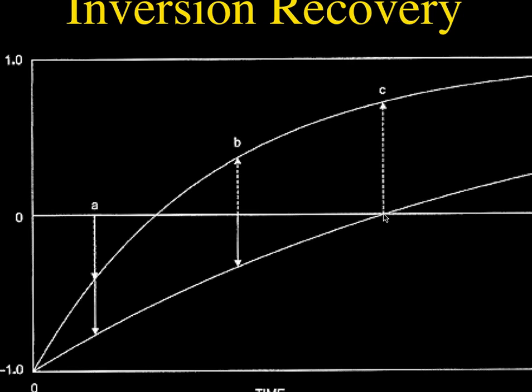It's a STIR. Well, I mean, it's called a FLAIR sequence, fluid attenuation inversion recovery, and both of these were really invented by Graeme Bydder when he was in England. Now he's down at UCSD. And we know that FLAIR is very important in brain imaging.